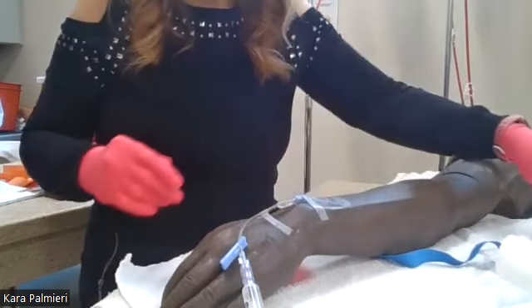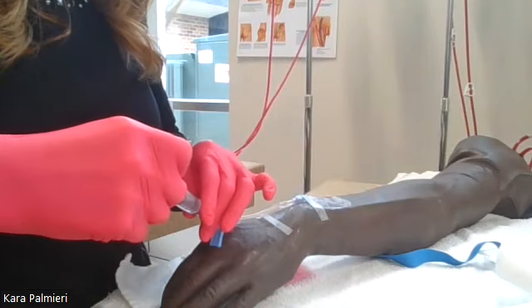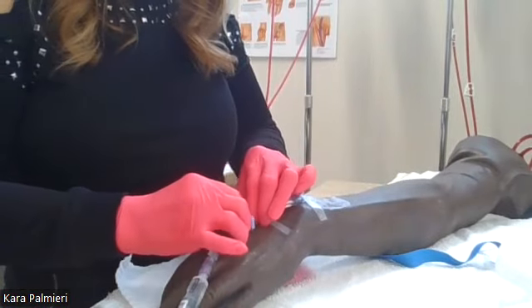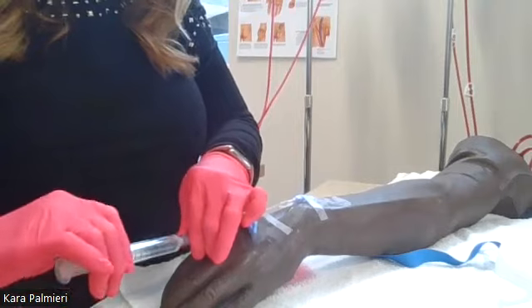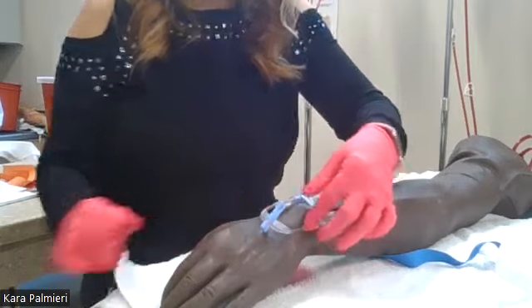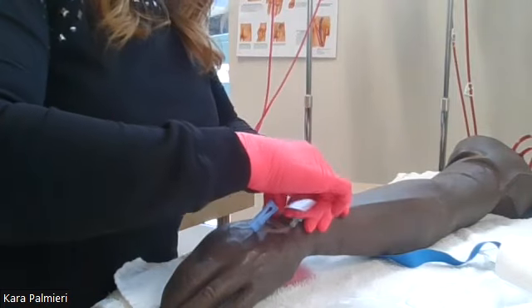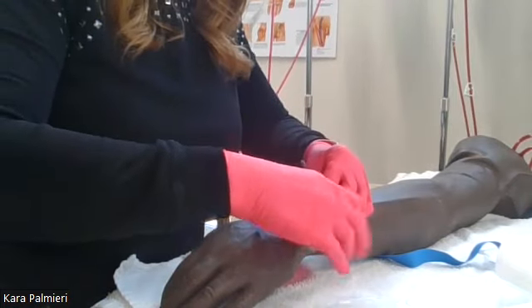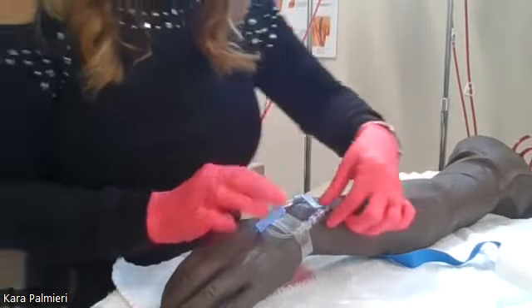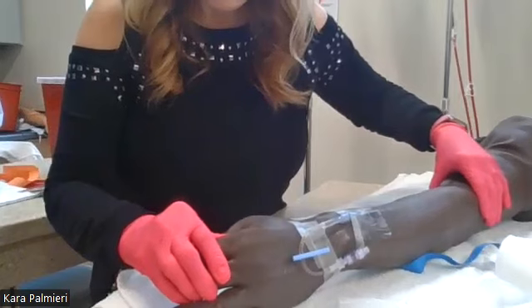Okay, that looks good. I'm just going to flush a little bit more. And I'm really satisfied with this, so I'm not going to flush anymore and clamp this off. Okay, I can take my lock flush off. And then I just take my J-loop and loop it up like this and take one of my other pieces of tape. Again, not pushing the tape into the patient's skin. So you don't want to leave any marks on them. But then I've got my pigtails easy to access right here. And there's my IV start.